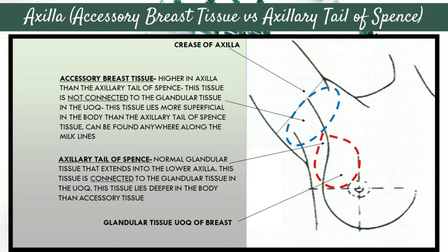Accessory breast tissue can be found anywhere along the milk lines. You may find it lower in the axilla in the same location as the axillary tail of Spence, but you'll recognize it because it's not connected directly to that tail of Spence or upper outer quadrant tissue, and it will be more superficial on the ultrasound image. You may also find it in the abdomen or even in the groin — it will appear as a superficial patch of white glandular tissue.